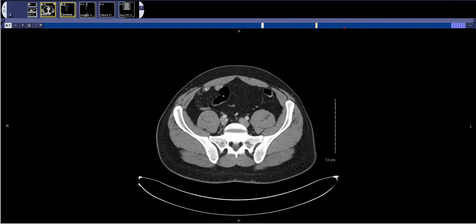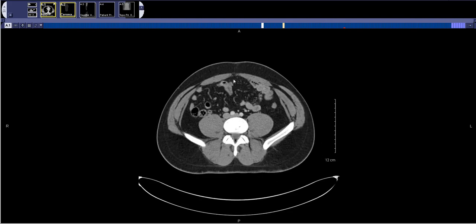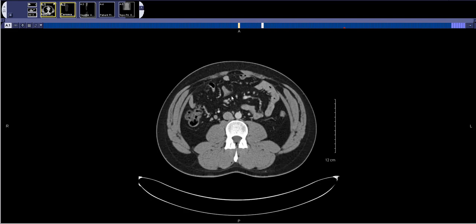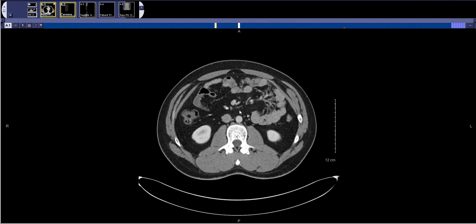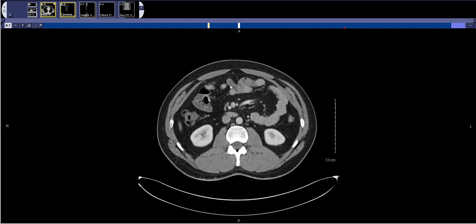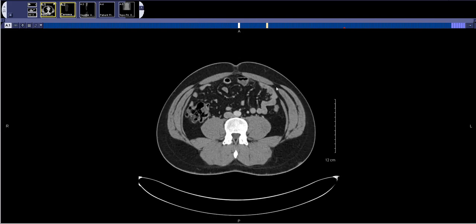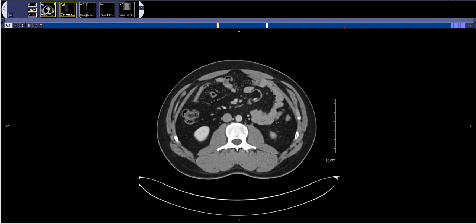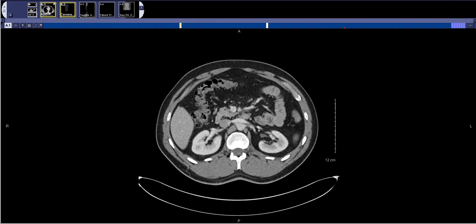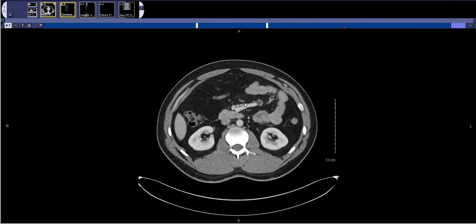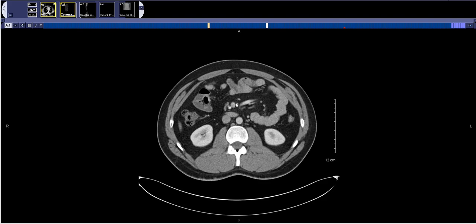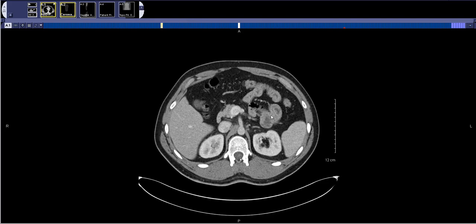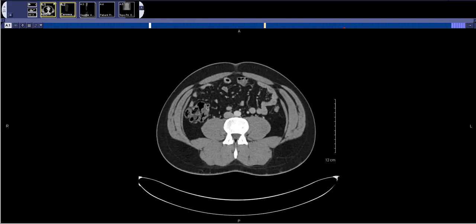Then I switch over to looking at the small bowel. Mostly I'm just looking through it in quadrants — I'm not trying to follow it if I don't think it's obstructed. I look at these loops of small bowel over here, making sure there's no mass or mesenteric adenopathy. Here are the mesenteric vessels — there are a few small mesenteric lymph nodes, but they're not very impressive. And after that, I pass the small bowel.